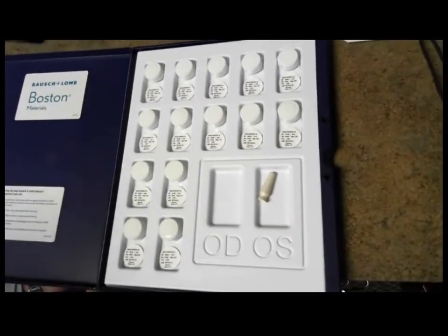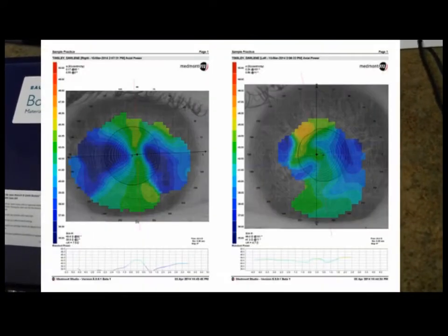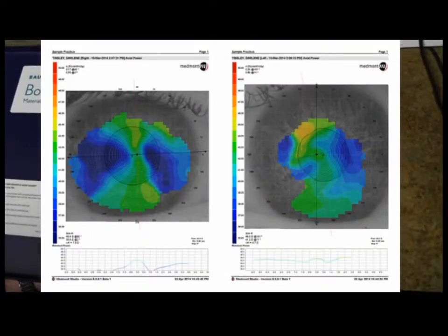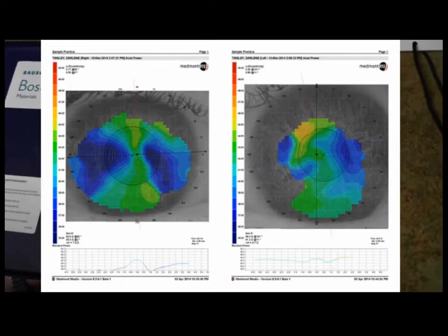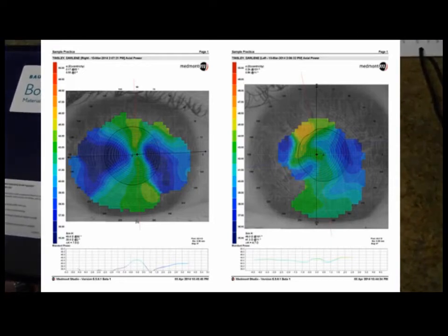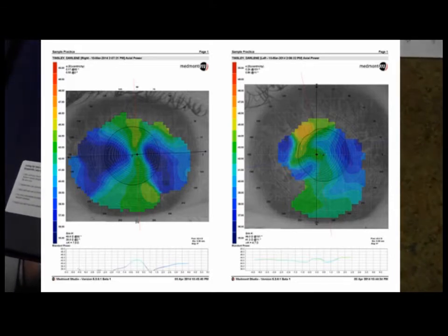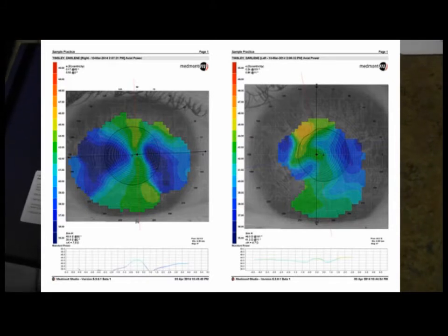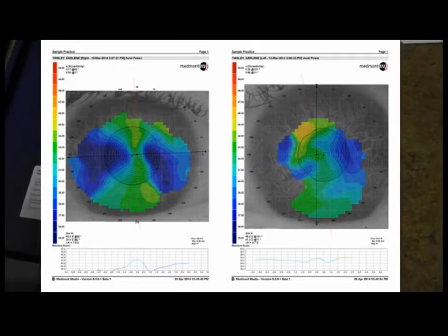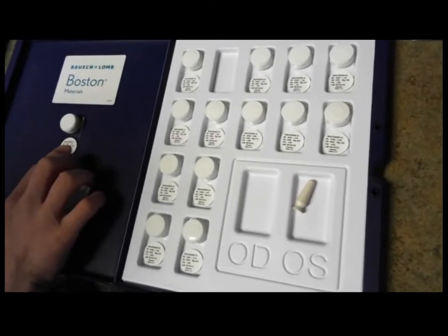So back to our topographies, and we'll look at these topographies again, because we're going to pick our first trial lens based on the topography. Now, it's very interesting. Muriel Schornack published a paper that said, essentially, you cannot base your trial lens fitting of scleral lenses on the topography. We published a paper in 2012 that backed up that same assertion. But nonetheless, you need to start somewhere. And so what we're going to do is start on K, on the steep K, sorry, on the right eye, which was right around 43. So we're going to select our diagnostic lens that is base curve of 43 for the right one.